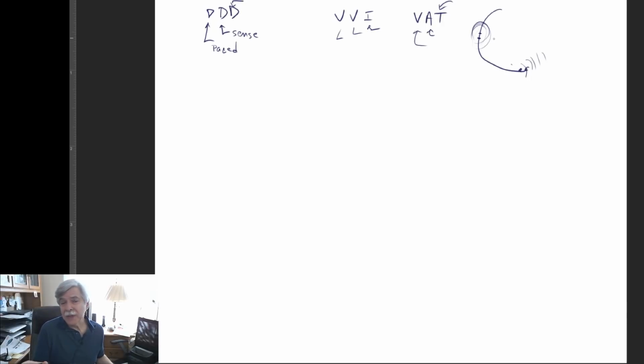And this was a perfect kind of pacemaker to use in somebody with complete AV block, because you don't really need to pace the atrium in that case as long as they have normal sinus node function. So that's where the T comes from, triggered. There are some historical things, but I don't want to get too bogged down. But when you have D in the third position, it means it can do both inhibited as well as triggered mode.